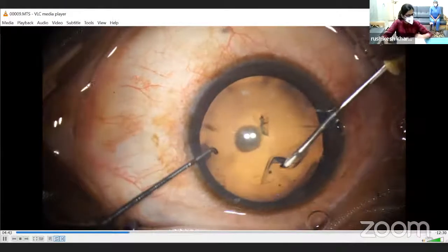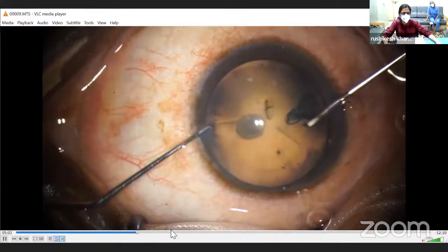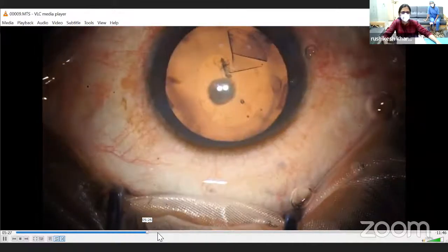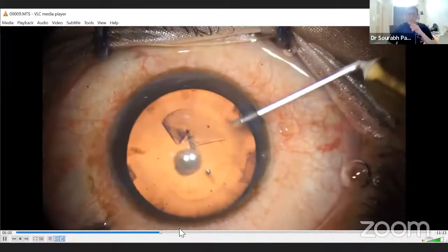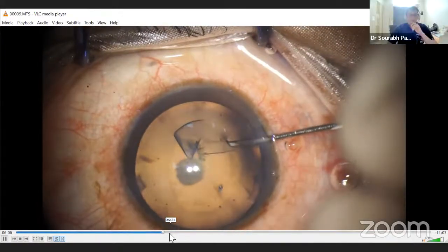This was a very soft cataract with the central dense PSC. So the patient was opting for cataract surgery. Younger patient? Younger patient, sir, 48-year-old. Okay.